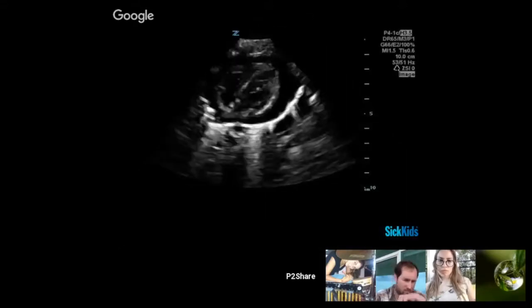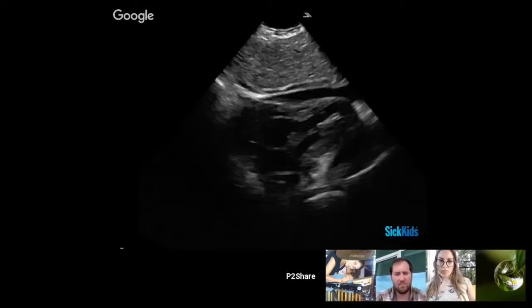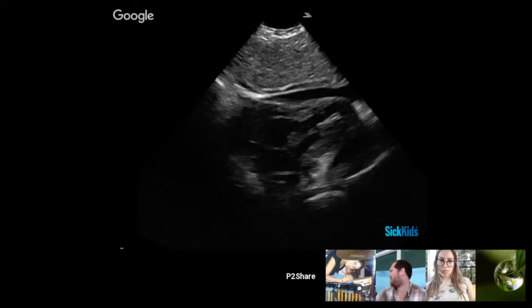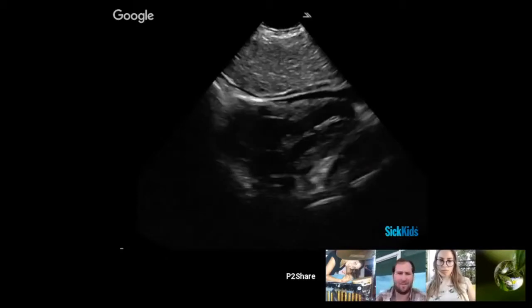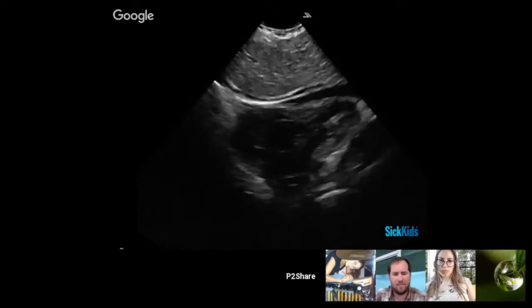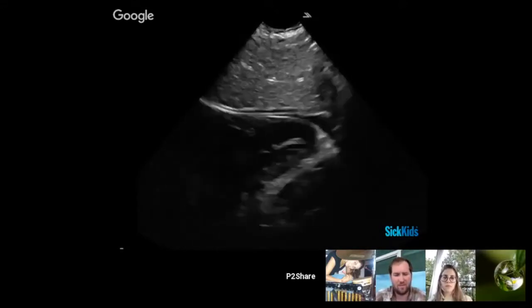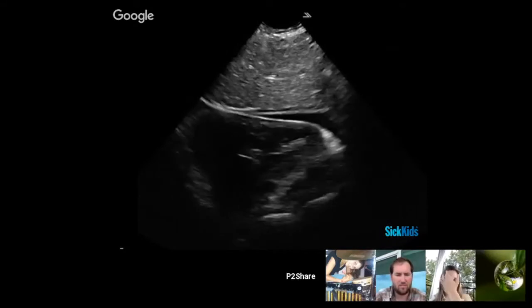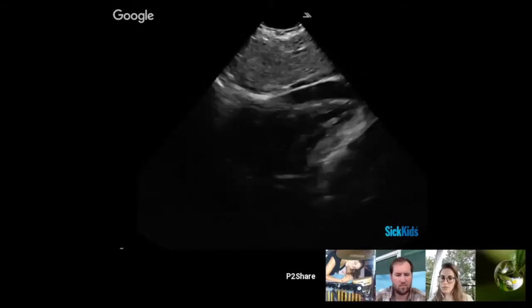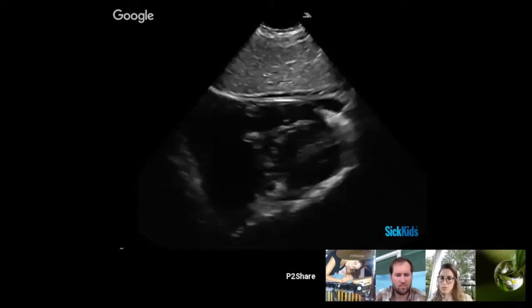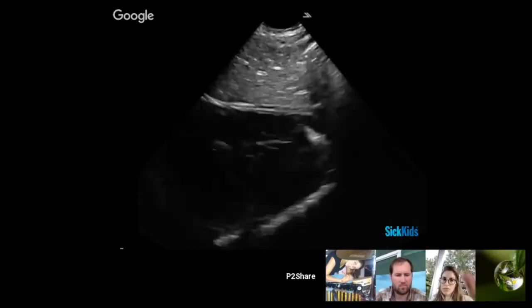The atrial sizes look fine to me, though I wouldn't usually use this view to assess that. Part of the problem is you always see the heart at a bit of an angle in the sub-xiphoid, so you're not really fully cutting through the ventricles. Comparing the sizes of the two isn't really the goal of this view.